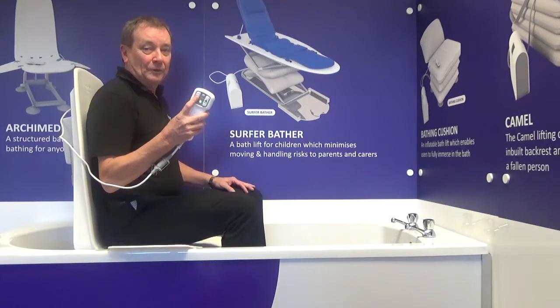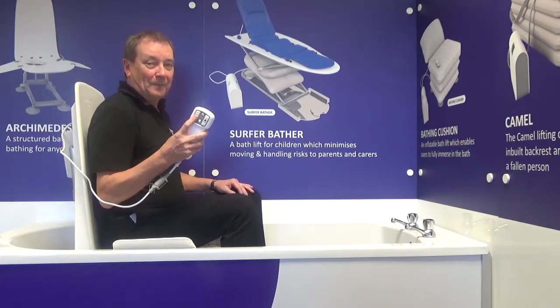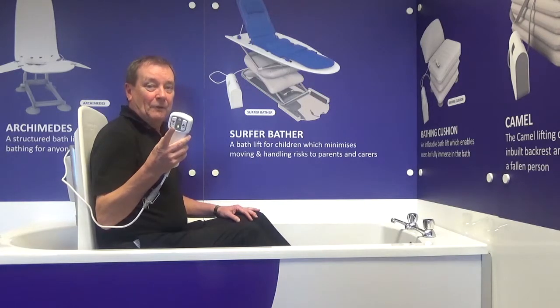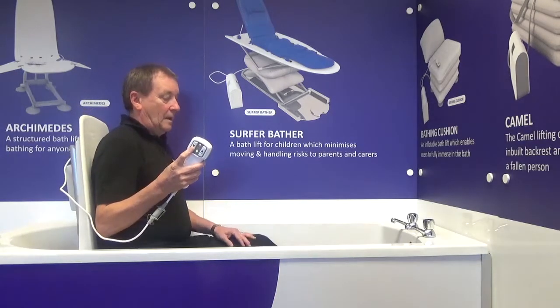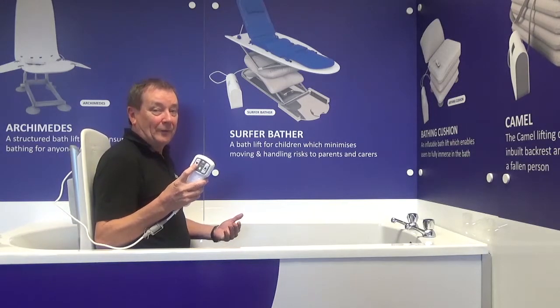Now it's time to go down into the water, so push the down button and I very gracefully lower myself down. As I'm part way down, I can start to move my feet out towards the taps, and if I want to stop at any time, just take my finger off the button and the lift will stop automatically. I'll carry on down, and we'll know when I'm at the bottom because the bath lift will cut itself out.